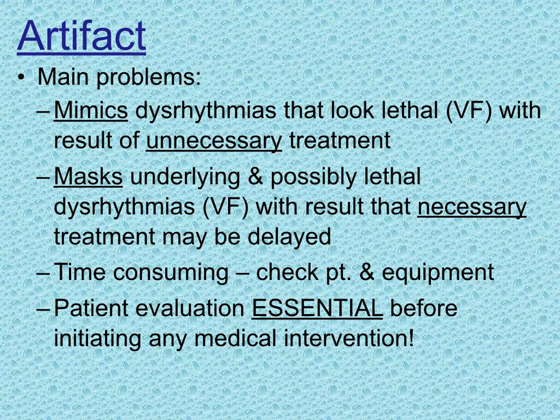Well, it could mimic a dysrhythmia. It could look like a lethal rhythm. Maybe we're going to go in and we're going to unnecessarily provide treatment to patients or cause a big commotion if we think somebody's in VFib, ventricular fibrillation. It could mask an underlying problem, and possibly a lethal dysrhythmia may go unrecognized. That could result in necessary treatment being delayed. It's definitely time consuming. We have to check the patient, we have to check the equipment, and it can just be something that's burdensome to staff and clinicians. So patient evaluation is always essential before initiating any medical intervention.